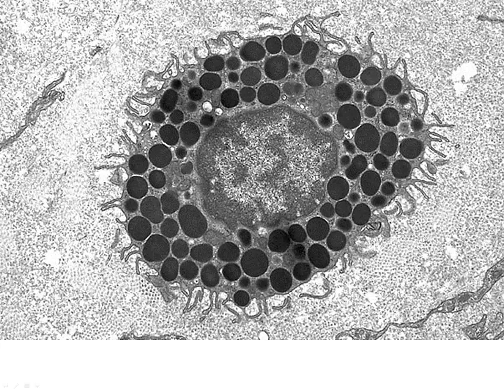Now the last cell we're going to look at, this is the cell that really can give us a lot of problems, especially as it relates to our allergic reactions. We see a lot of these specific granules. These are much larger, and you see they're more round than we saw with the eosinophil. We're not necessarily going to see that externum and internum structure that we saw, the crystalline structure. These are going to almost obliterate the nucleus at the light level. And you can see we've got a lot of these processes as this cell is in the process of degranulating. This is going to be in the tissues. This is going to be our mast cell. And in our circulation, what do we call a mast cell in circulation? A basophil.